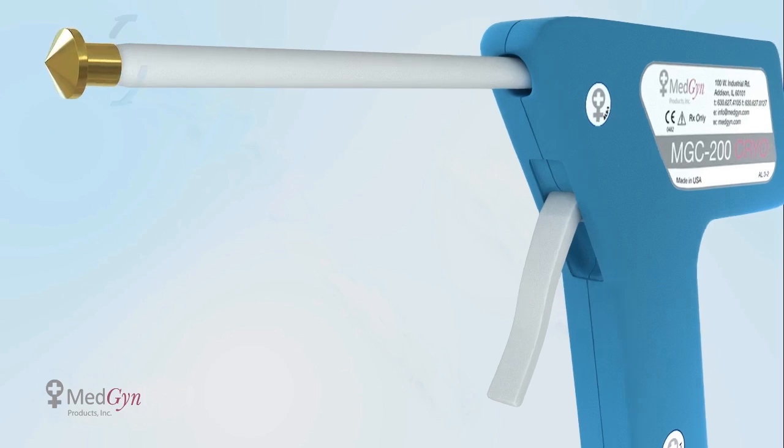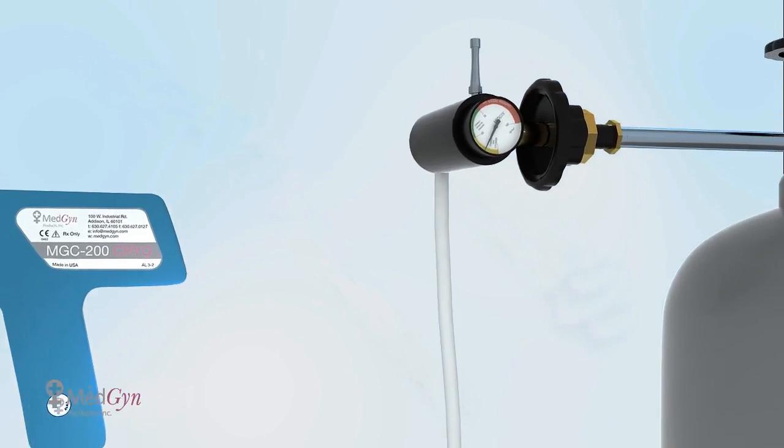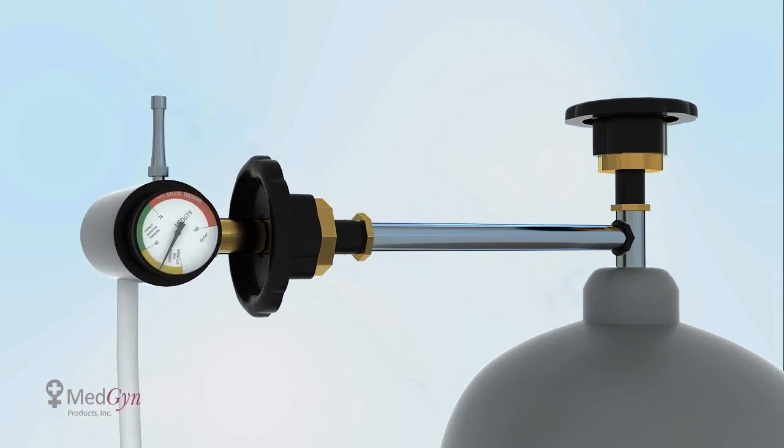Next, connect the pressure gauge to the gas tank. Slowly open the valve on the gas tank. Make sure you verify the pressure on the pressure gauge.